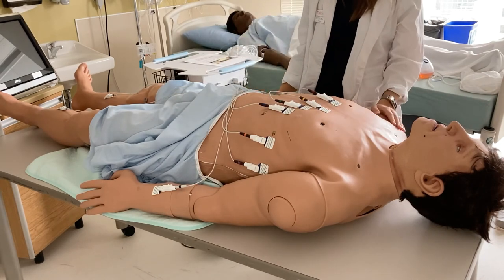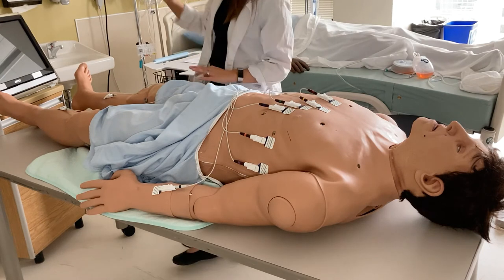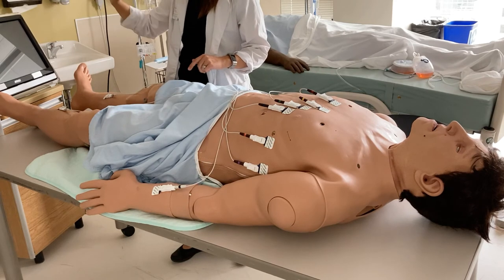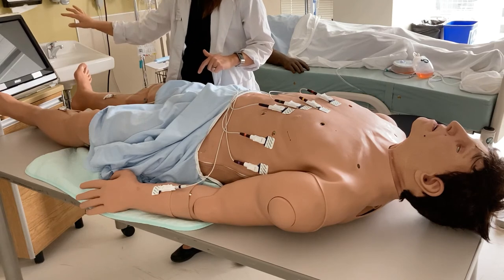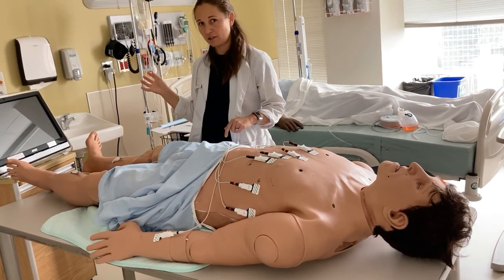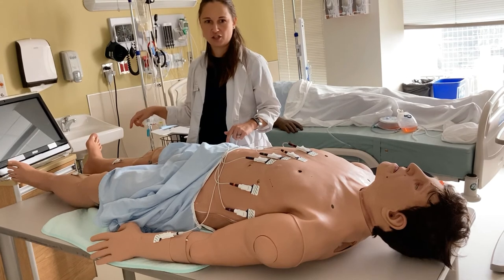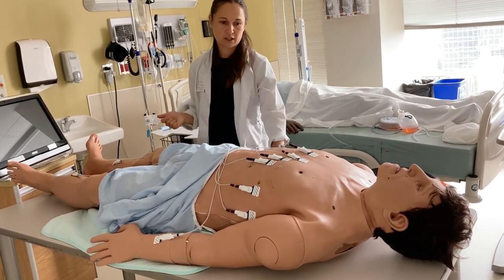Now we're ready to take the reading. At this point I tell my patient to breathe normally, try to relax, and try not to talk for about 30 seconds. Then I go to the monitor and select 'Read EKG' — some monitors have a large button that says EKG. The machine will begin to calibrate, normally showing three dots: red, yellow, and green. Once calibrated, the system gives a green dot and you can press print or EKG again to take your reading. At that point your EKG is done and you can disconnect your electrodes.